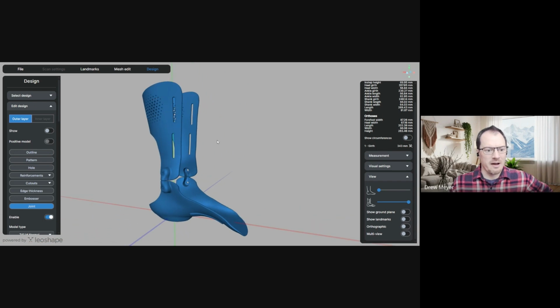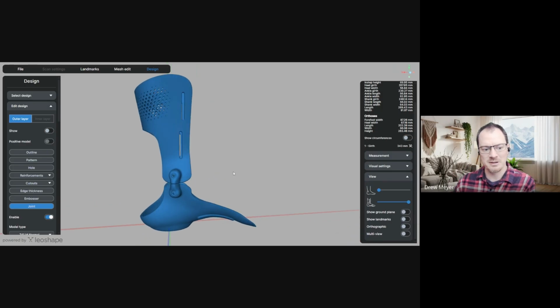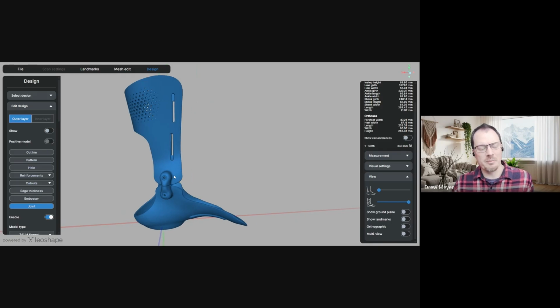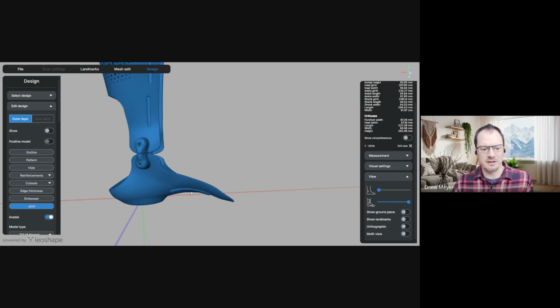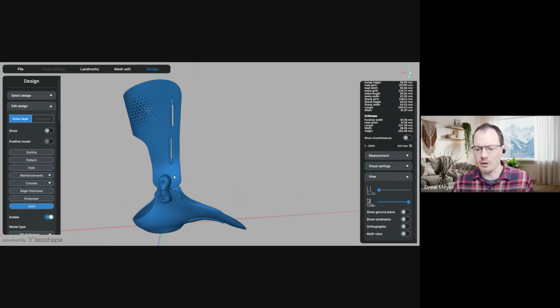So this is, I think, becoming something that I've seen a couple of people do: FDM printed these devices, and I've been really impressed with the final results. So things like this are possible. Obviously, when you powder bed print these, there are some more optimizations you can take advantage of, like variable thicknesses, tapered trim lines, and smaller, finer features that are just going to show up better on a powder bed print.